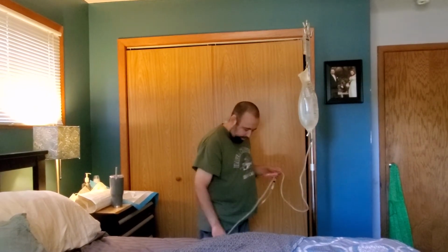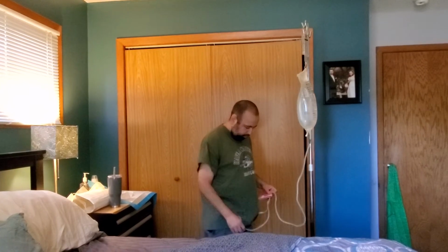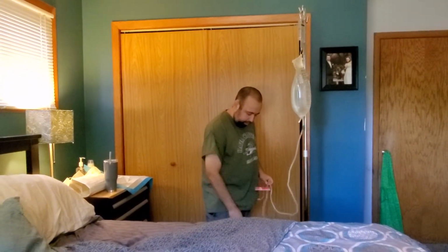Okay, that's done, and I can see that some fluid drained into the drain bag from there, which is normal. And now the line is primed and ready to fill.